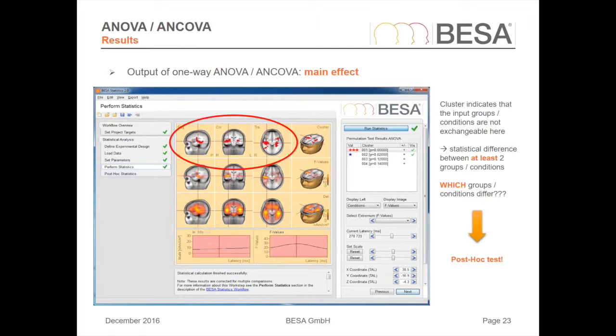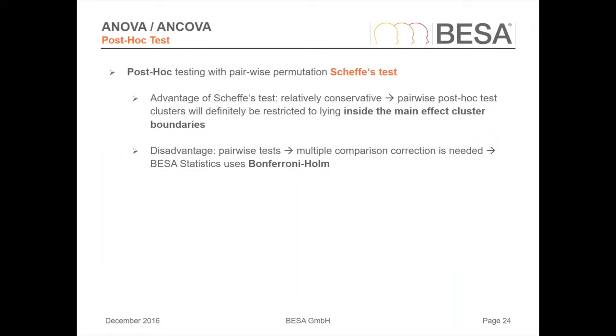To answer this question, we need a post hoc test in case of the ANOVA or ANCOVA. For the post hoc test, we decided on the Scheffé test because it's relatively conservative. So the pairwise post hoc test clusters will definitely be restricted to being inside the boundaries of the main effect cluster.